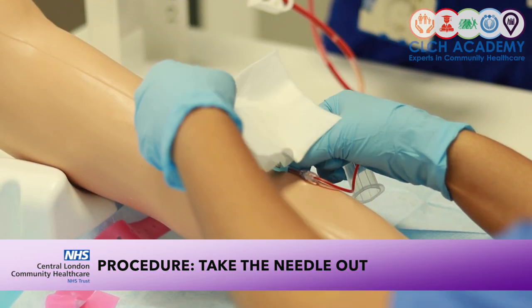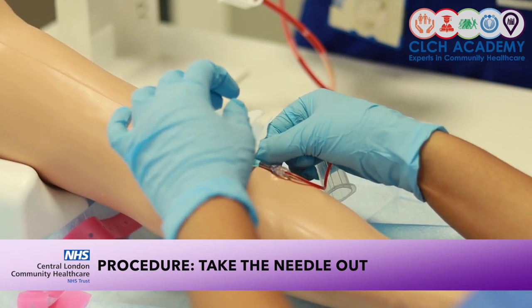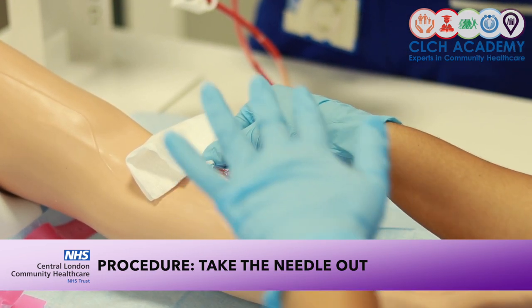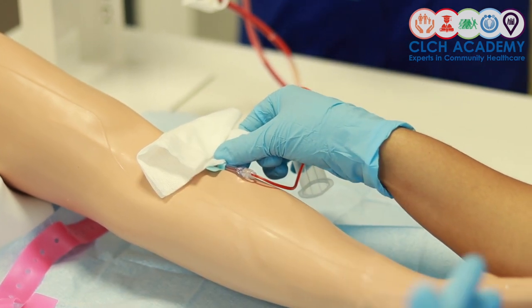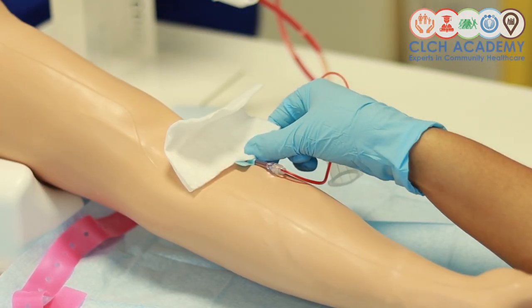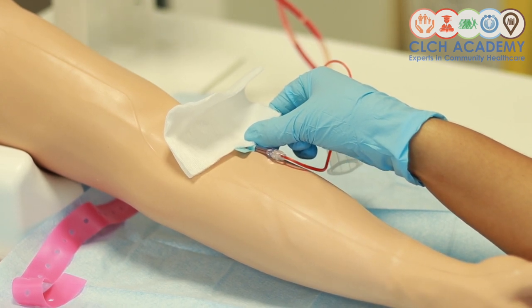I'm going to lay my gauze lightly on top. That's just so that if my patient is needle phobic, they don't get a full visual of the needle. Maybe the thing to highlight, notice at no point did my hand leave the needle dangling in the air. My rationale for doing that is so that the patient doesn't assume I'm finished and move their hand, and then I dive for it, and that's likely to cause myself a needle stick injury.